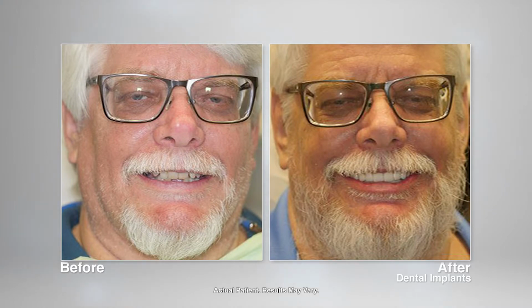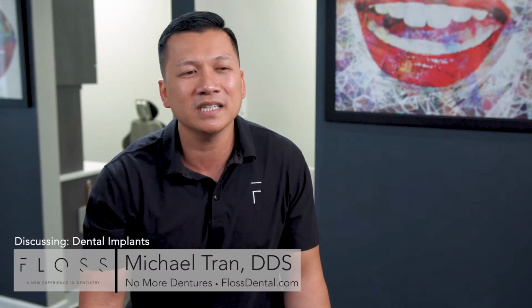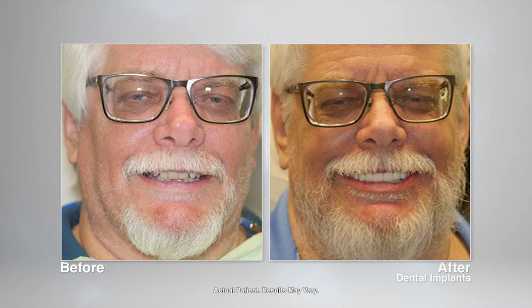So these teeth don't come out at all. They're just like regular teeth. You have to take care of them also. Your implants you have to take care of also. So he comes in every 6 months. We'll clean around the implants, give him a cleaning, and he's very healthy. And we'll keep the implants clean so they can last the rest of his life.